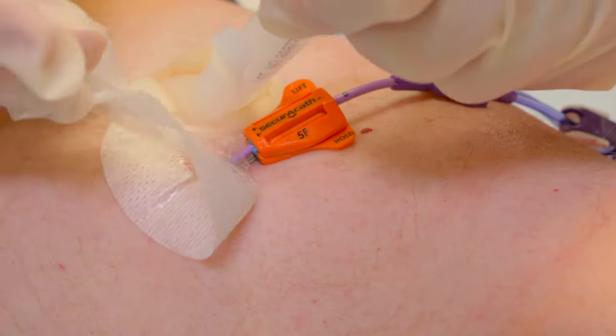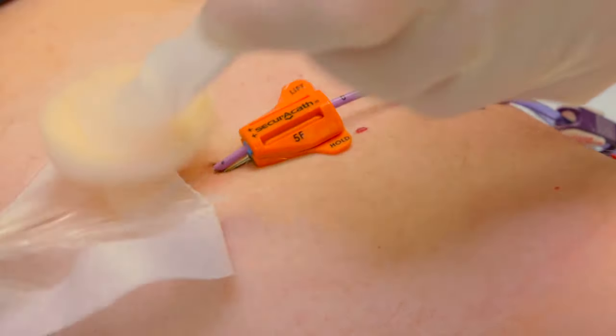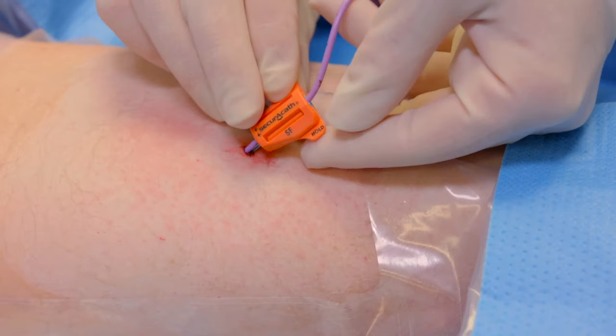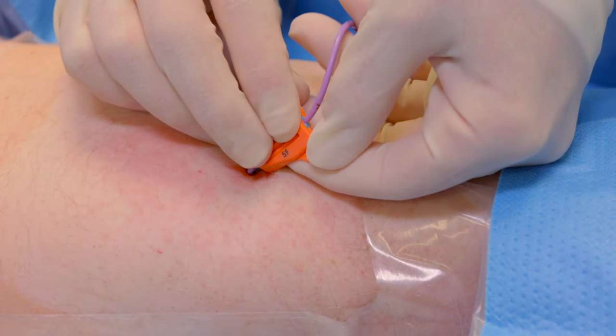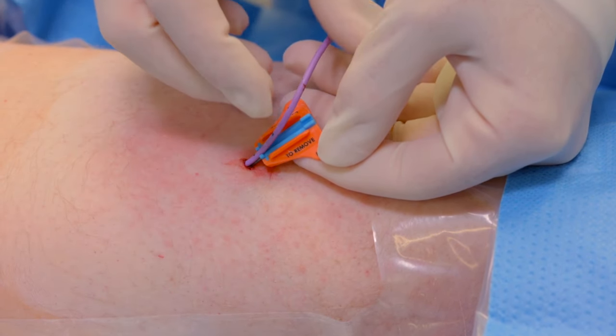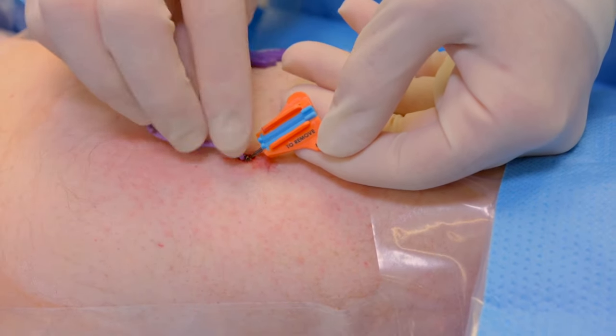Remove dressing. Grip the hold tab on the SecuraCath with the thumb and finger of one hand to stabilize the device and the securement feet beneath the skin. Pry upward at the edge of the lift tab with the index fingertip of the other hand to release the cover from the base.